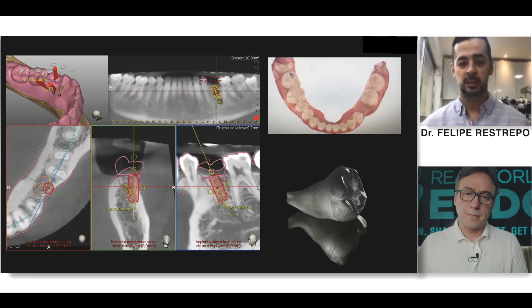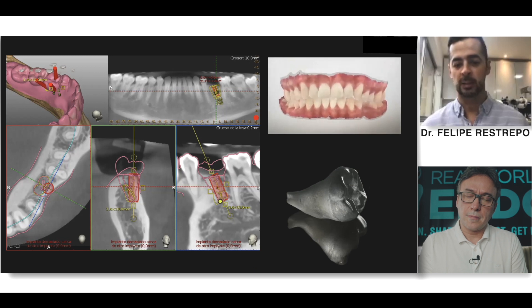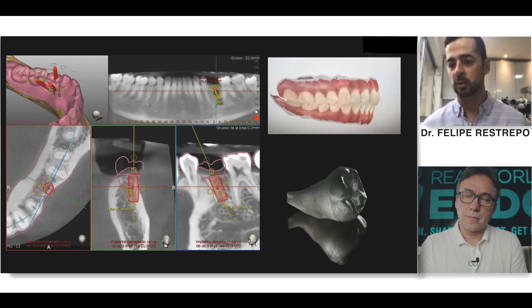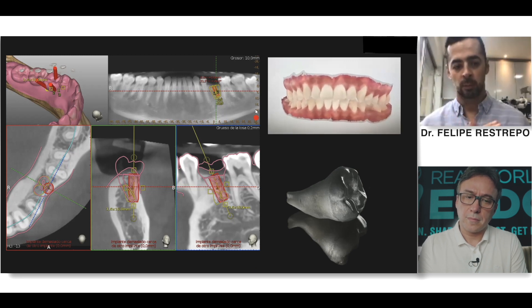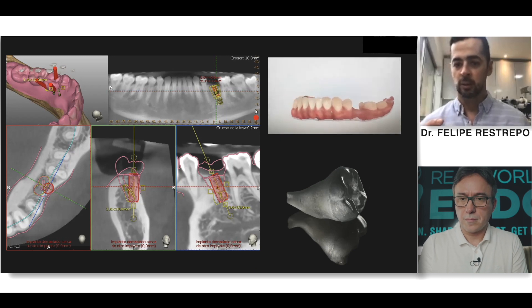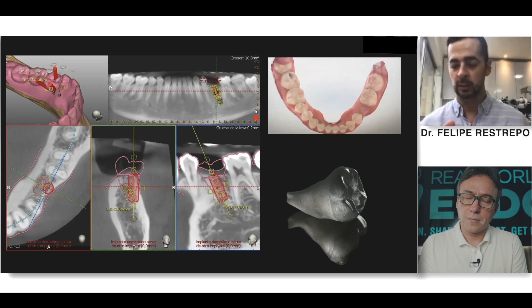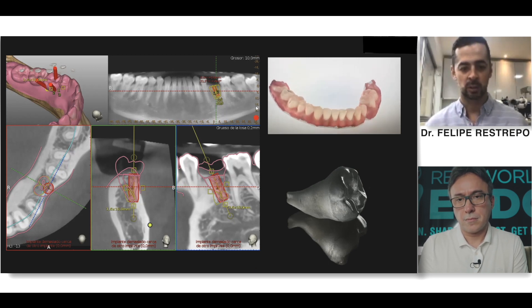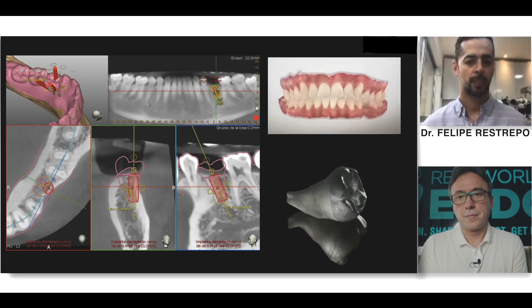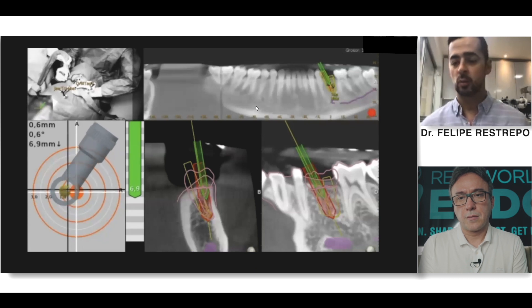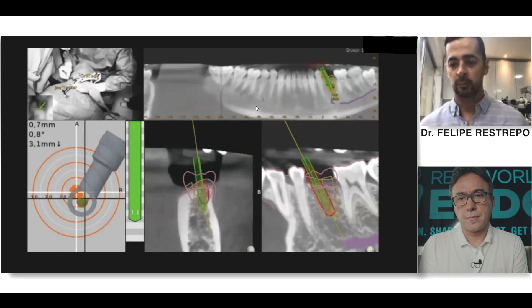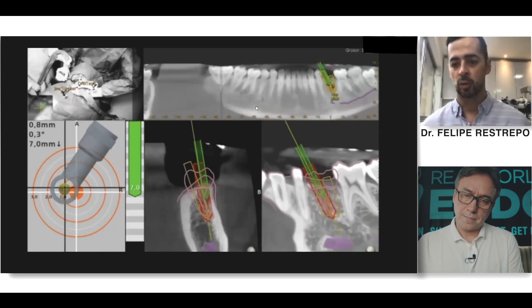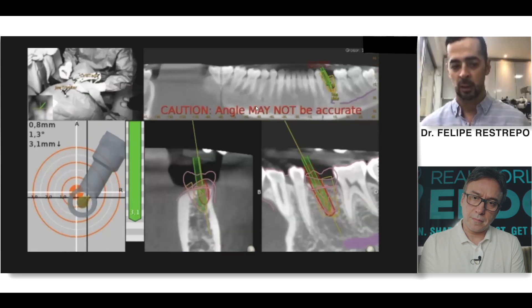What we have here is the new STL with the tooth already transplanted digitally. You can see the 3D silhouette in pink of the transplanted tooth. With this, we plan three or four implant osteotomies fused together to create one big socket able to receive the donor tooth. The dynamic navigation device I use is called Navident. In Navident, we see real-time feedback of where we're drilling, three-dimensionally, in the icon of the patient. You see the CBCT and see exactly that you're drilling through the path you planned in advance.